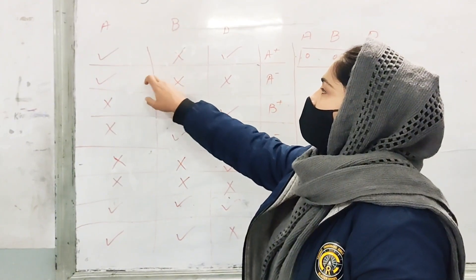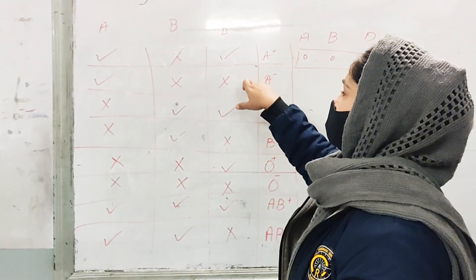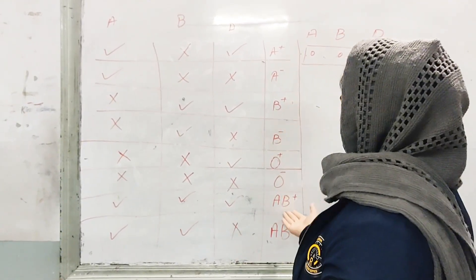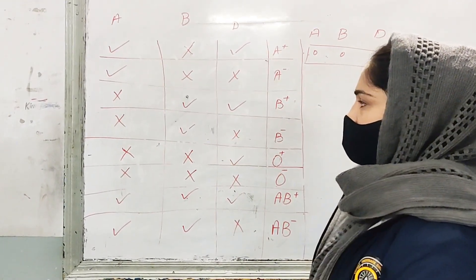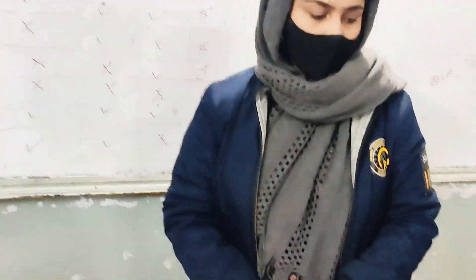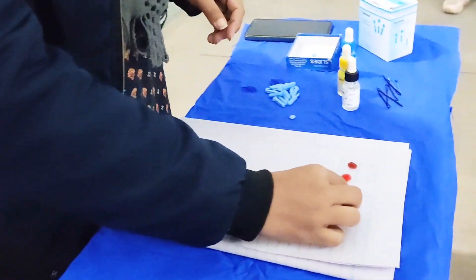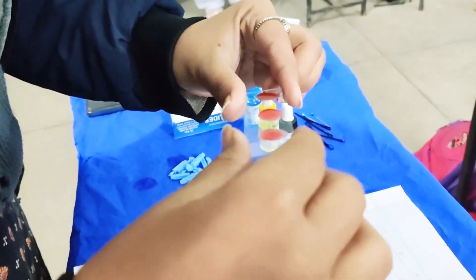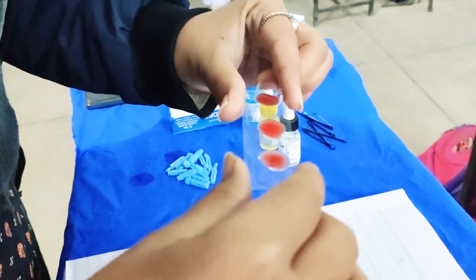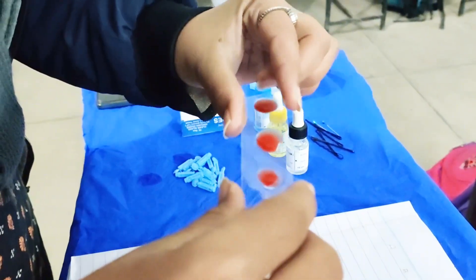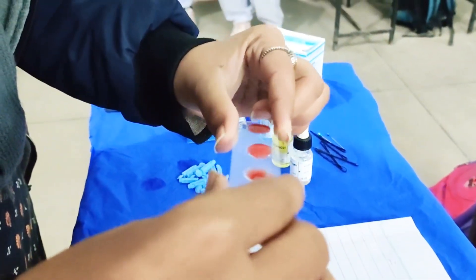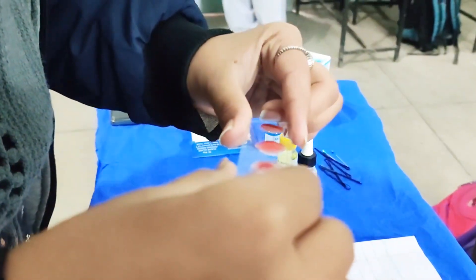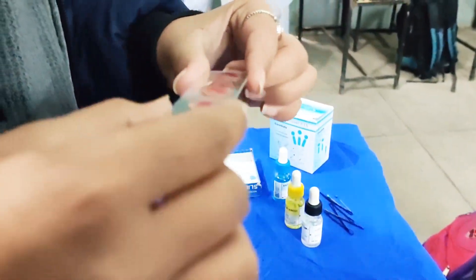If we look at A and D and there is no clumping of cells, then we will know that the blood group is negative. Let's see what the student's blood group is — is there clumping or not? We are looking at A, B, and D. We give it a few seconds so we can tell the exact blood group to the student.